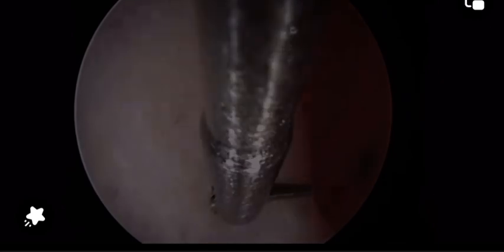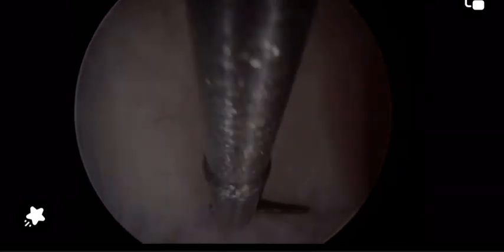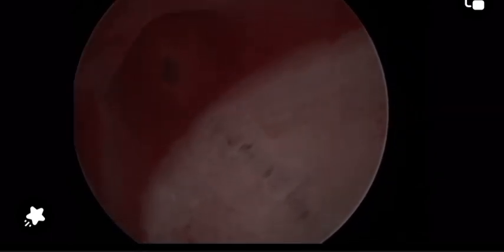Look at the pink part of the uterus, which was the original cornua, and look at the white new surface area. Oh, this is a new surface area added to the cavity of the uterus. So the septum is just cut and released. It is not excised. Enjoy the beautiful final view.